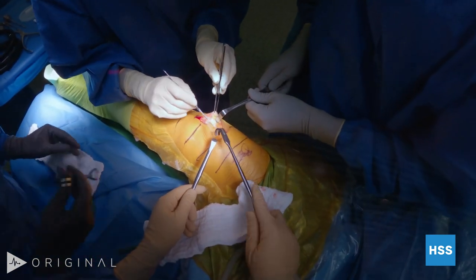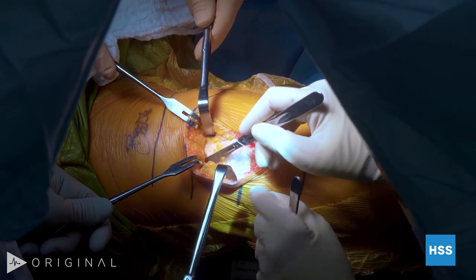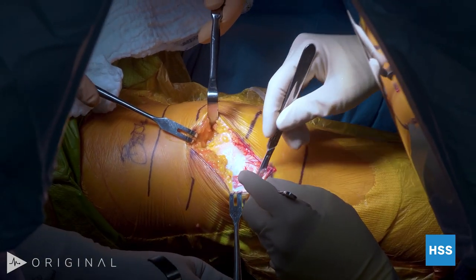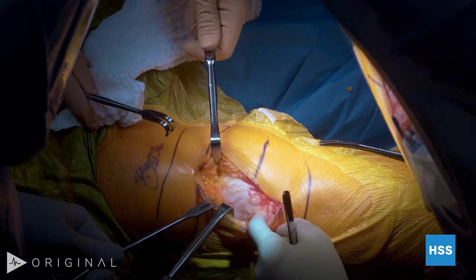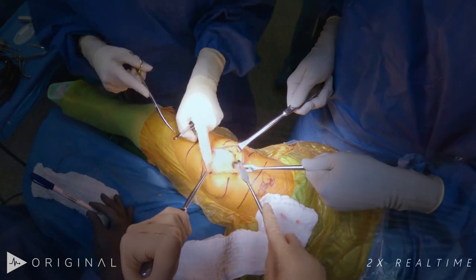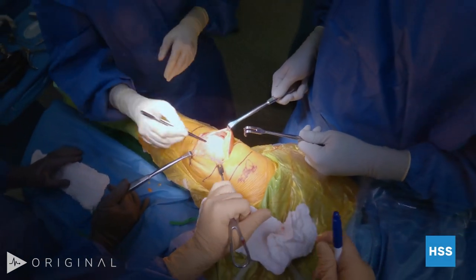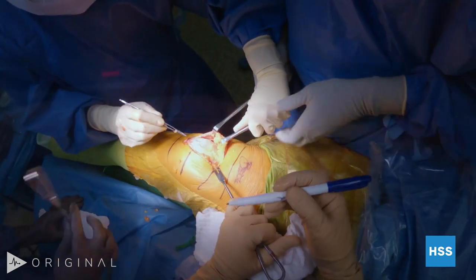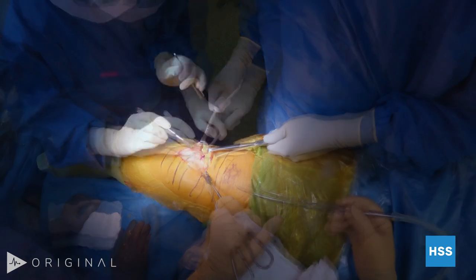We're doing a slightly different approach today than the most common approach. The most common approach for this is a medial peripatellar arthrotomy on the medial side. But because of her malalignment arthritis, we're going to do a lateral approach so that we can also treat the subluxation and tilt. The first step is to develop what we call a mobile window. We try to do these through relatively small incisions — if you can develop that window, you can do the same surgery through a much smaller incision.